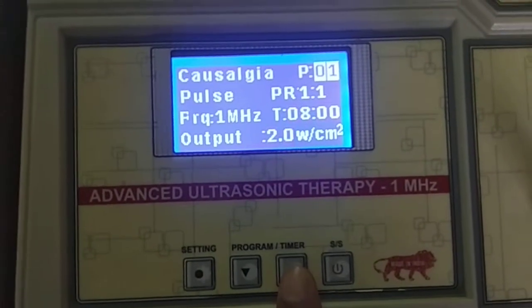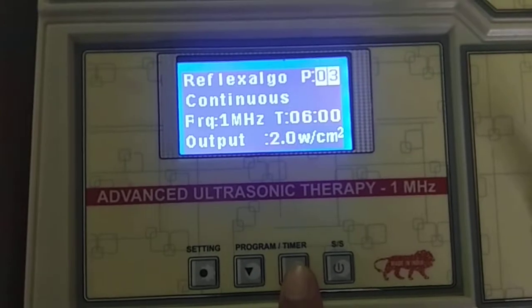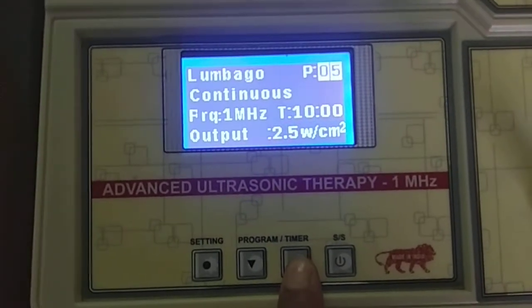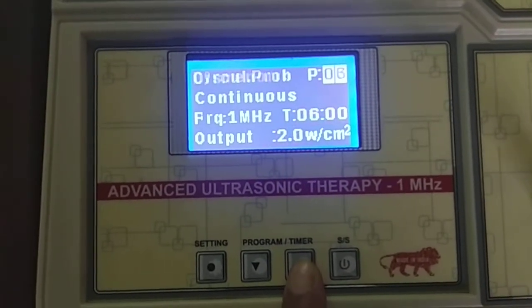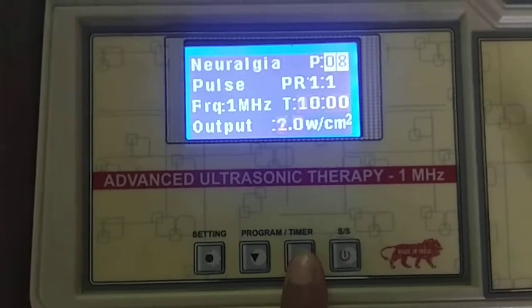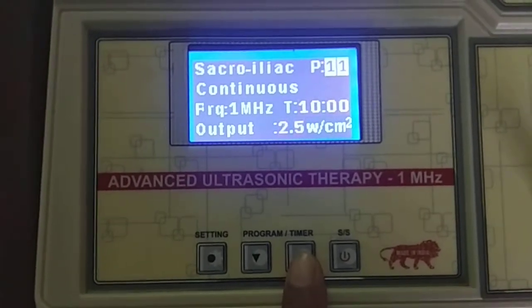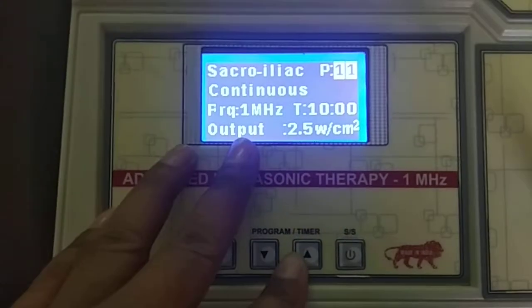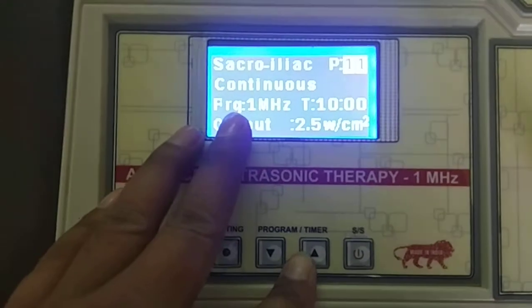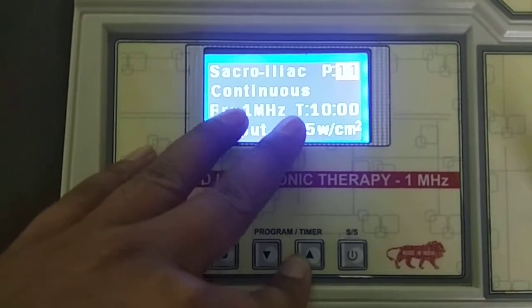You can scroll through Program 1, 2, 3, 4, 5, 6, 7, all the way to 55 programs. In Programs mode, Frequencies and Treatment Time are fixed.